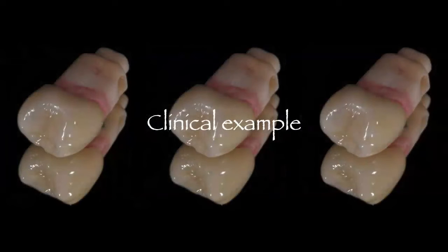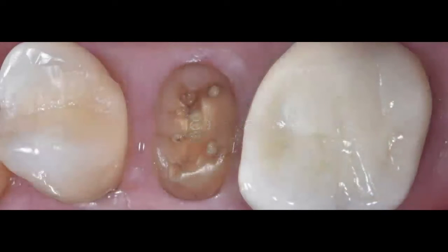Now, in my practice, I do a lot more onlay restorations than full coverage crowns. I have to sometimes replace crowns, or sometimes I have severely broken down teeth that I want to give another chance. And this is a clinical example of that. I want to just walk you through the whole process. You're just combining the concepts of preparation and final delivery of the restoration, just to clarify some questions that you may have, just because I specifically spoke about the actual cementation or bonding of the restoration. But this is a different case.